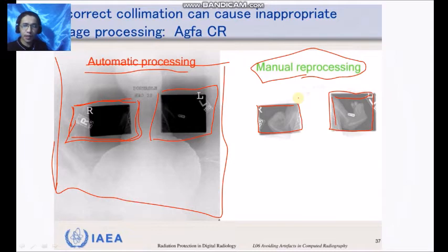Okay, comparing the factors when it comes to abdomen and chest, abdomen requires an increase in the technique factors. Okay, so if we would use the technique factors for abdomen to expose the chest, that would result in a very dark radiograph.